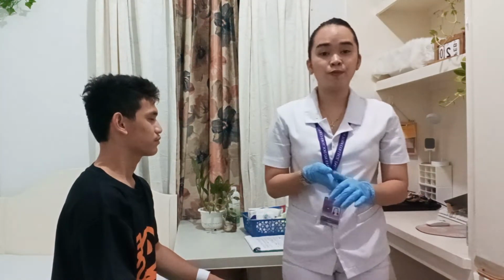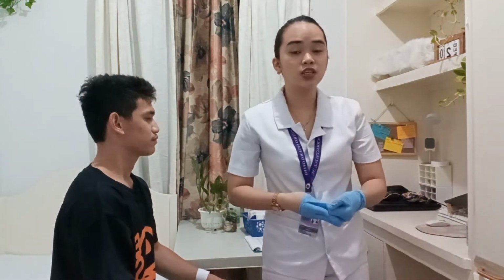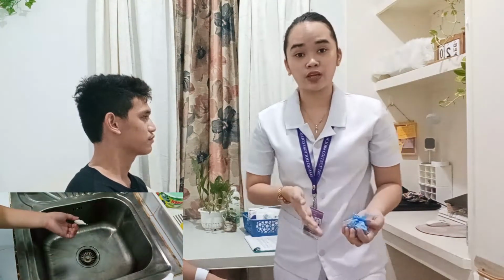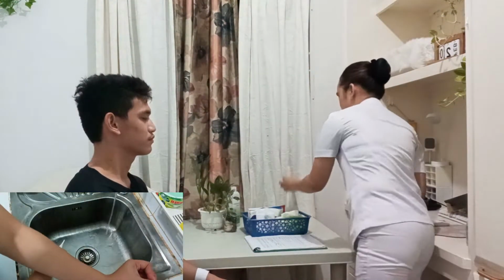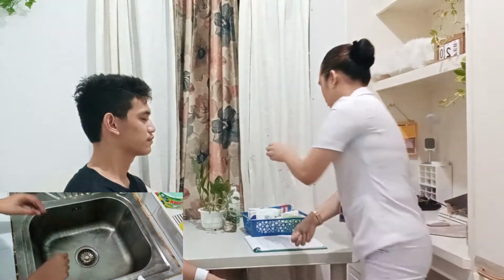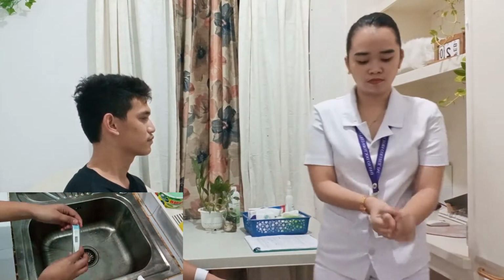Now I'm going to remove my gloves and perform hand hygiene to prevent the spread of microorganisms, and I will wash the thermometer for further disinfection. Now that I'm done disinfecting, I will document the temperature of my patient to his TPR sheet.